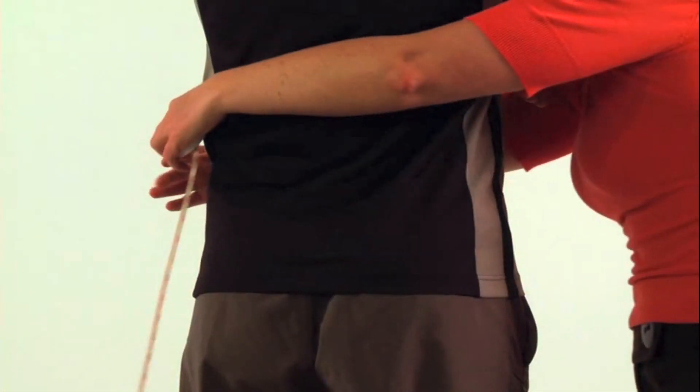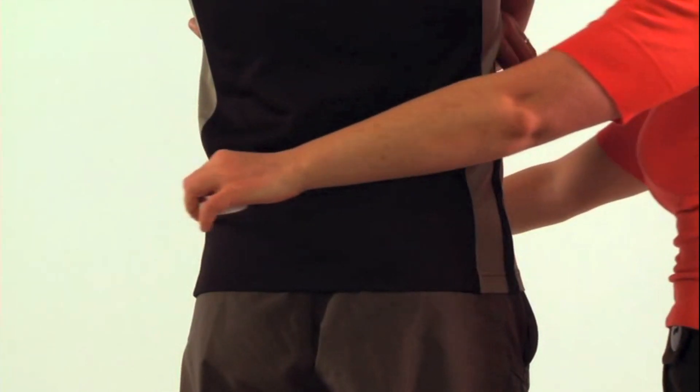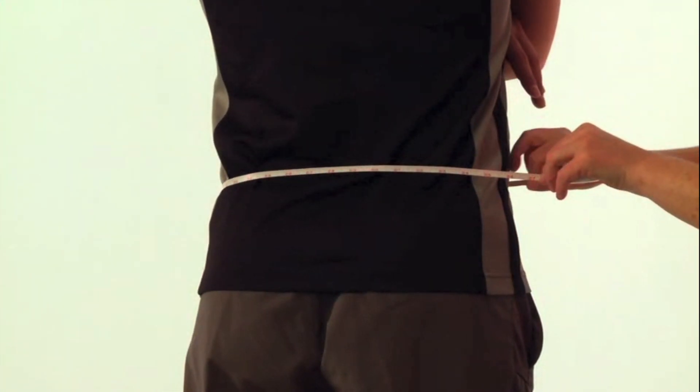To determine the required size, take a measurement around the waist. Compare the measurement to the sizing chart on the package to determine the corresponding size.